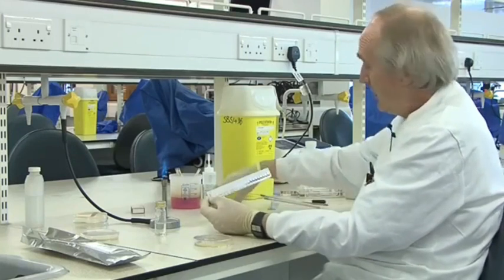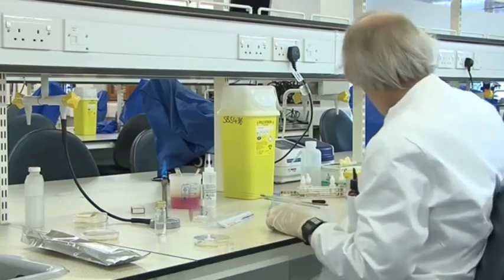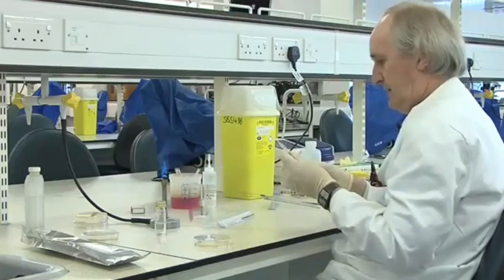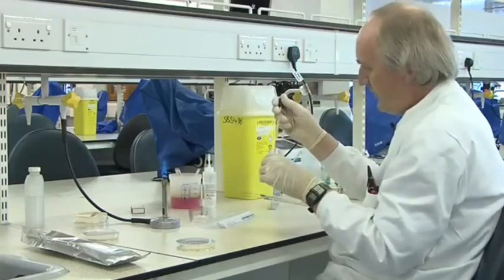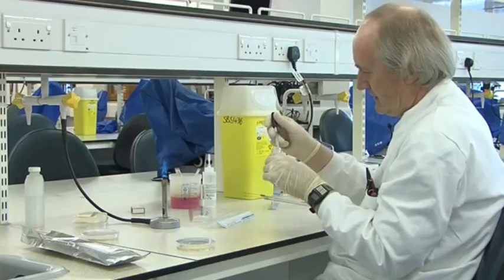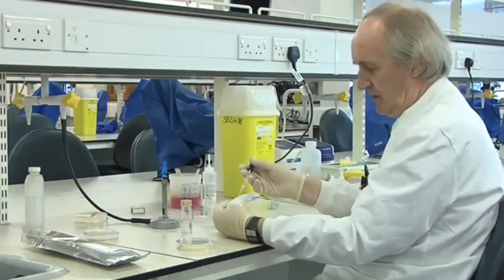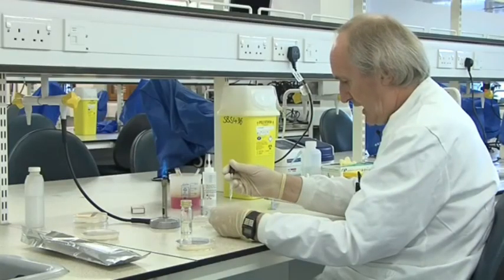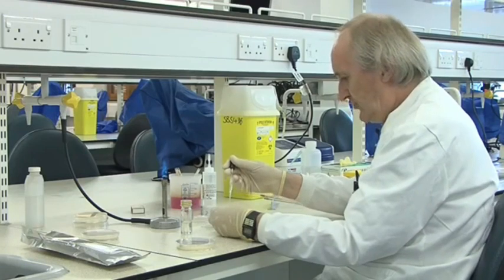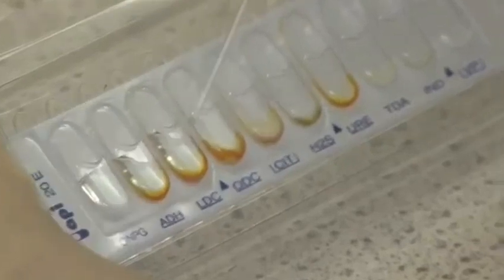I put the strip there and pop it up, then I need a Pasteur pipette. This is our suspension — a pure suspension of the unknown bacterium, number one in this case. You just fill up most of these compartments just to the top. ONPG, which is a test for beta-galactosidase, is really an analogue of lactose and it changes colour. Then arginine dihydrolase, lysine decarboxylase, and ornithine decarboxylase.